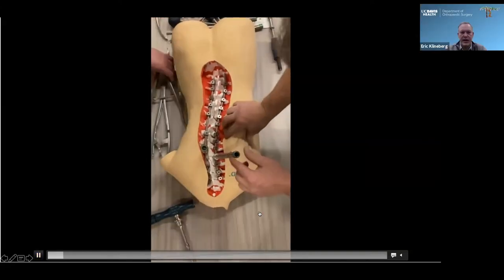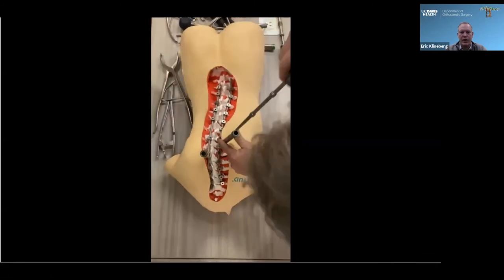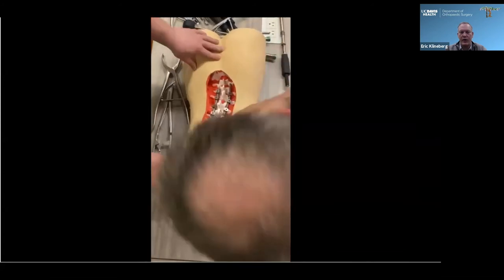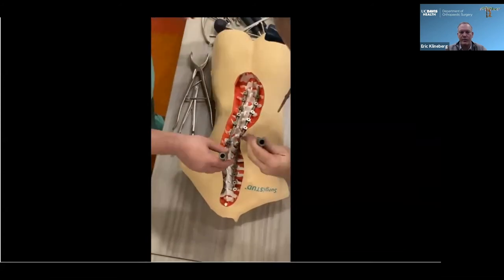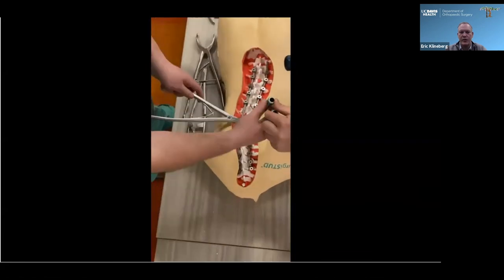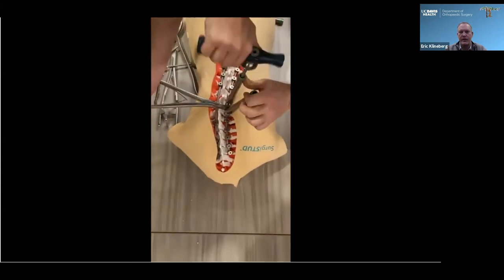So let's just get a sense about where the rods are in space. We're going to pick that neutral vertebra, and we'll go ahead and tighten, lock that down. I'll work a little proximal first. So the left side, I'm going to put two rods. We do our derotation and get some length through that mid-thoracic spine.